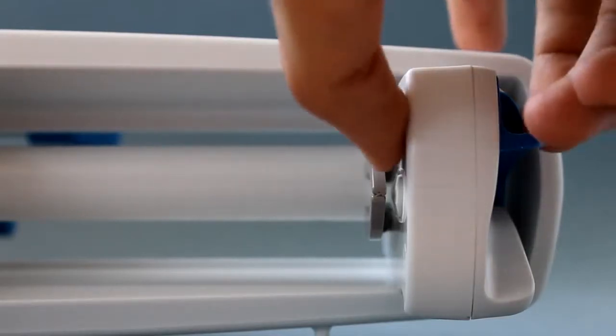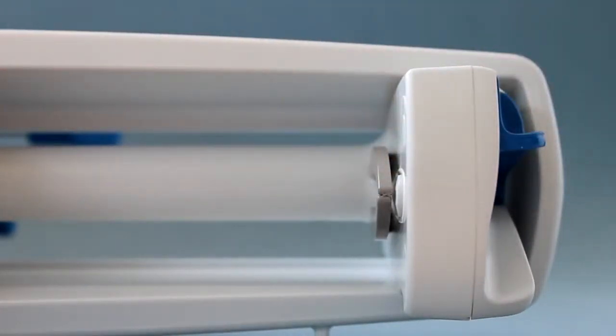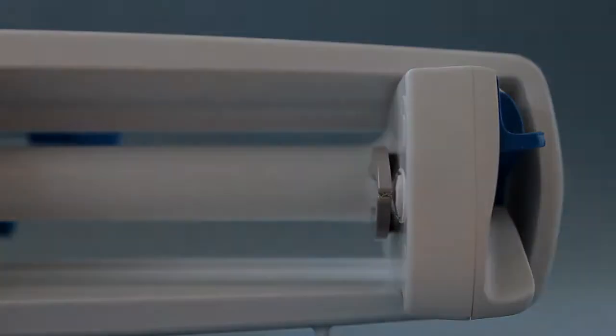Press the plunger head detection finger. A click is to be heard. Check that the anti-siphon arms are moving back towards the plunger driver.